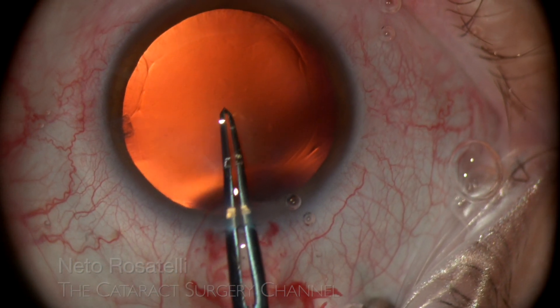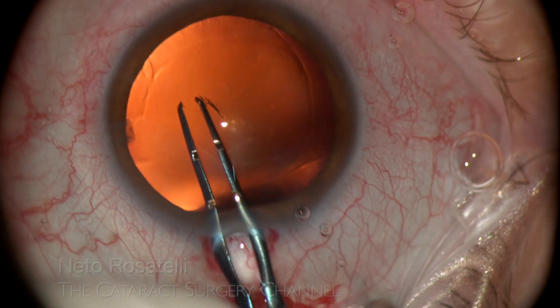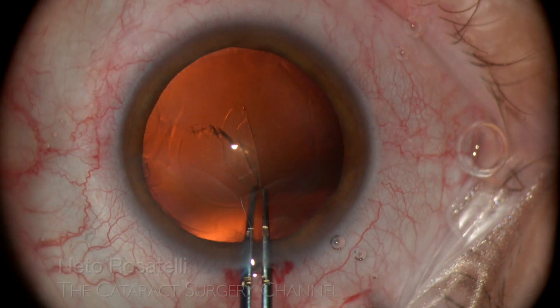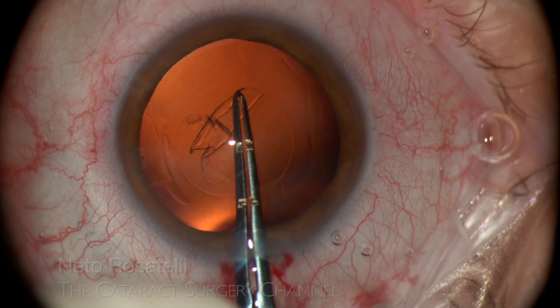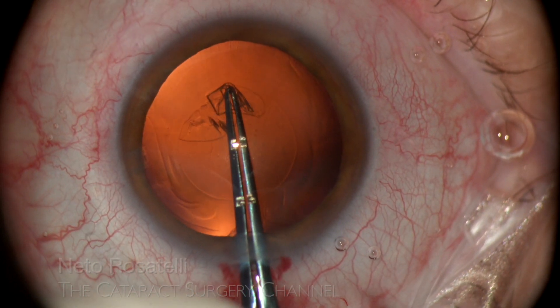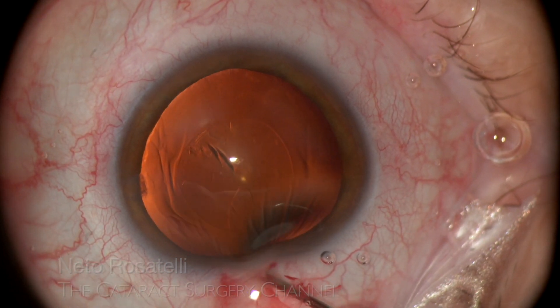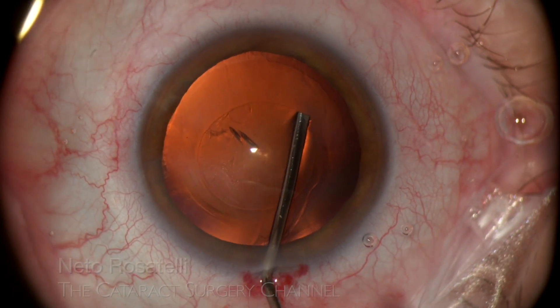Now comes an important aspect. It is difficult to gauge capsular rhexis size in these big eyes, so an engraved capsular rhexis forceps helps in making an appropriately sized rhexis and avoids problems such as unwanted IOL optic capture or anterior dislocation. In this case it may look small, but came out 5mm exactly.